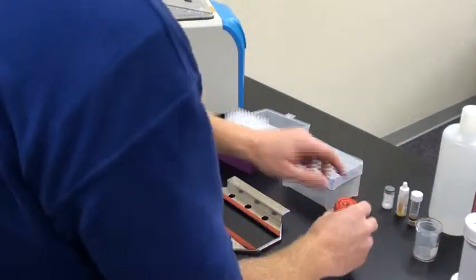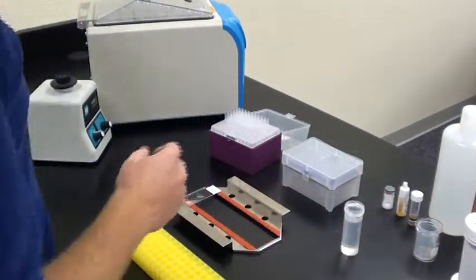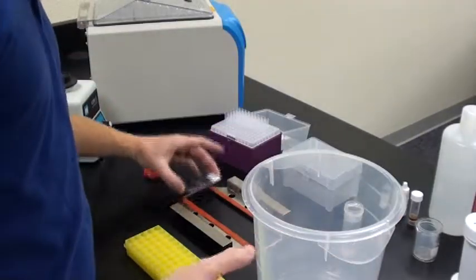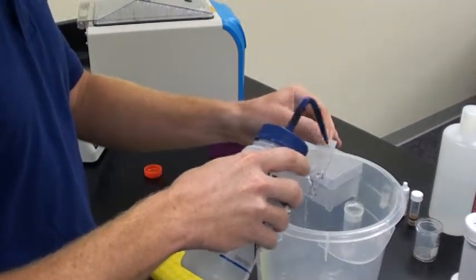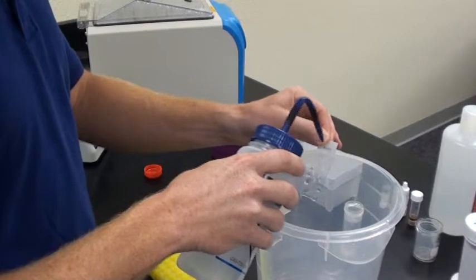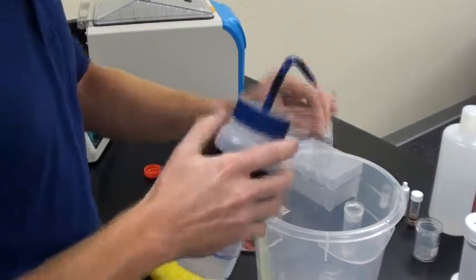After 10 minutes, it's time to remove the proteinase K from the tissue section. It's really important that you don't leave the proteinase K on any longer than 10 minutes because once it's finished digesting those ribonuclear proteins, it's going to start digesting our target. So if you have to leave it on for 9 minutes, that's fine. 10 minutes, no problem. But try not to go over.